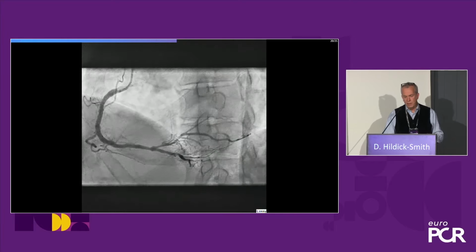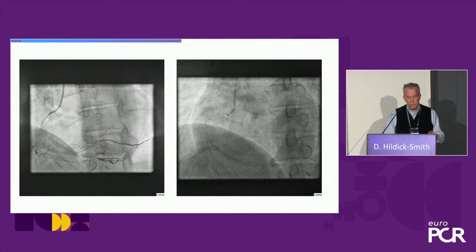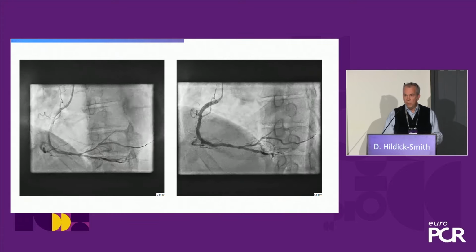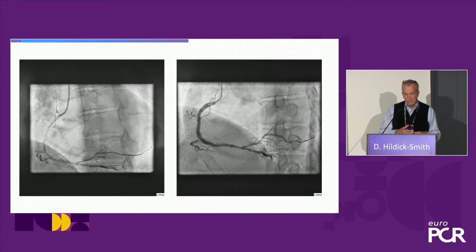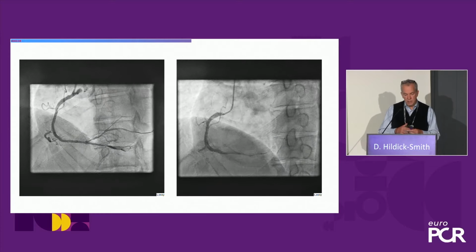This was a clinical episode on the left-hand side. And actually, if you compare the results of the angioplasty itself on the left-hand side with the result a few months later, I think you can see what you would expect, which is that the previously slightly vasoconstricted vessel has now dilated of its own accord. All its motility is restored.